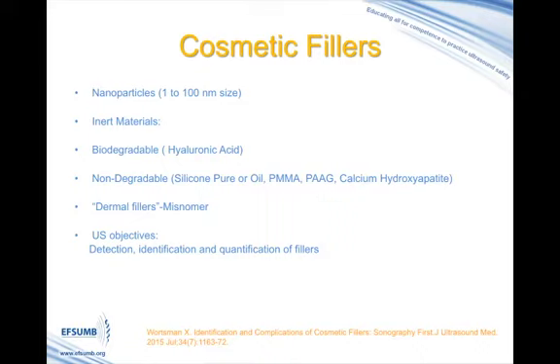These fillers sometimes are called dermal fillers, but dermal fillers is a misnomer because usually the majority of the deposits is located in the subcutaneous tissue.